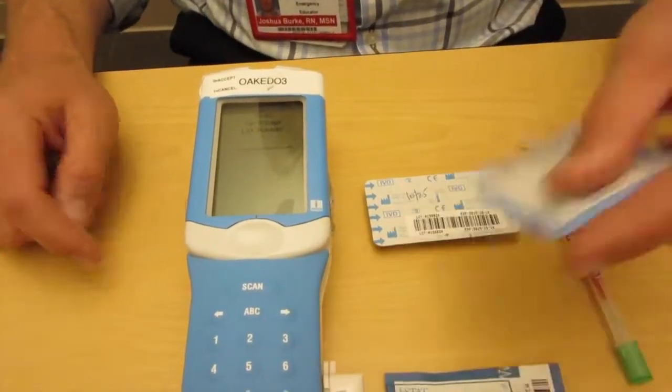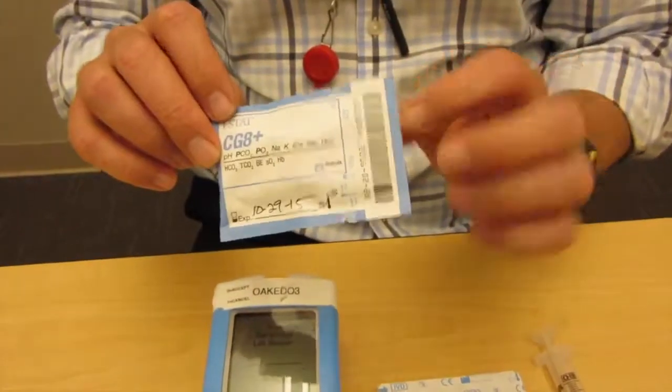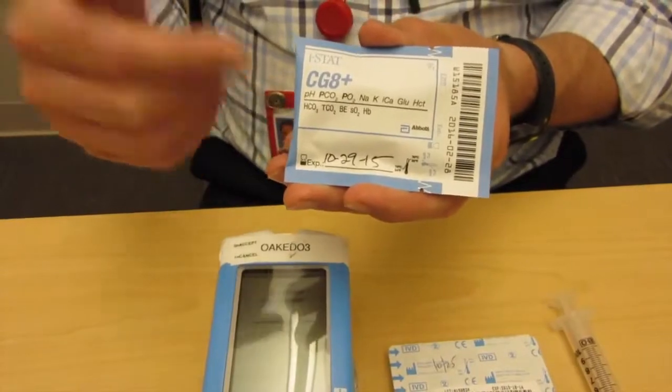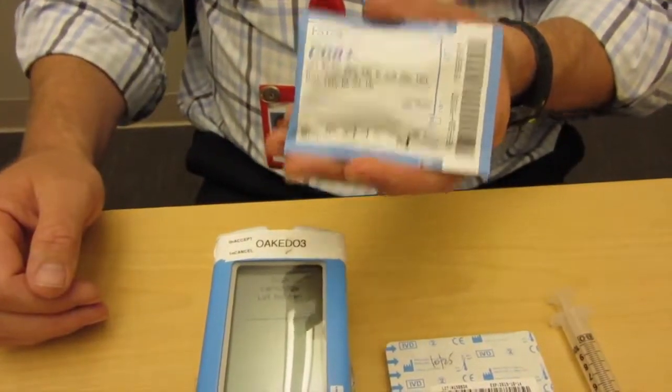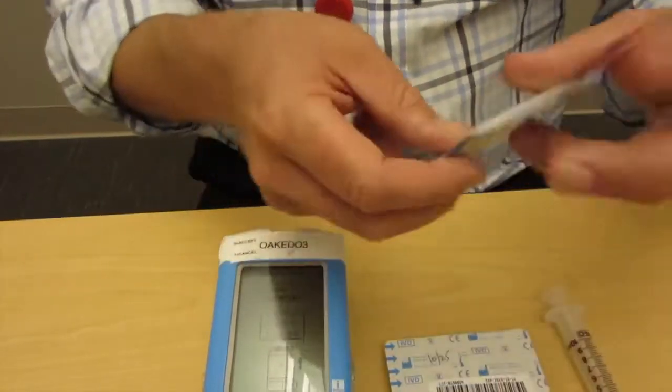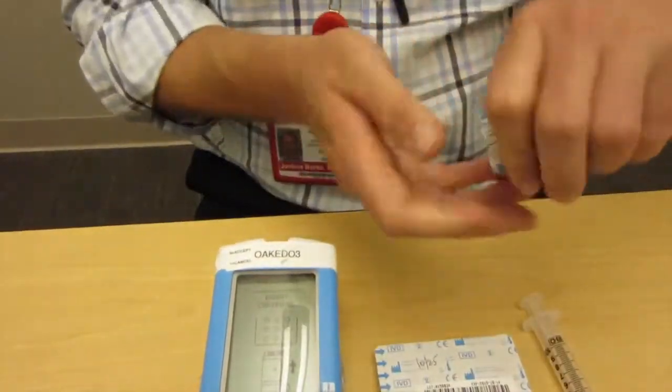Then we're going to scan a cartridge lot. For this demonstration, I'm going to use the CG8 — that's a full chemistry, a full gas, and an H&H. These are amazing: you get all these results in 120 seconds. Really, really cool cartridge. We're going to press scan, and now we're ready to take the cartridge out.